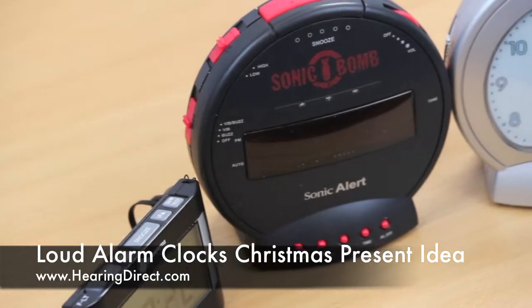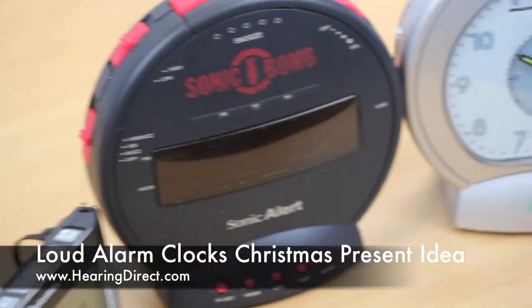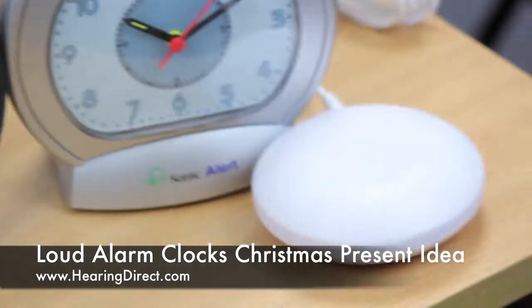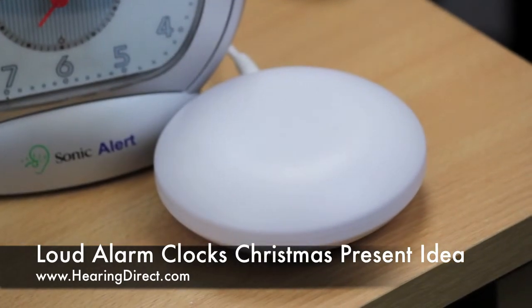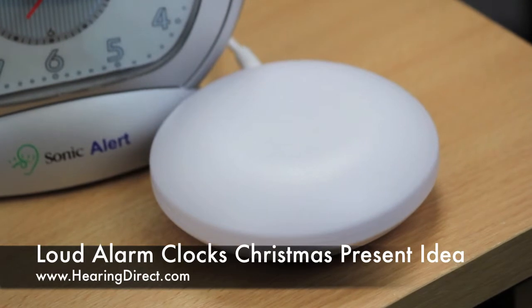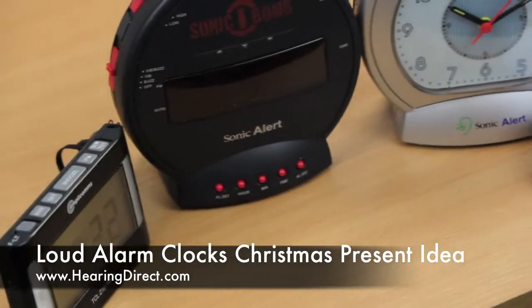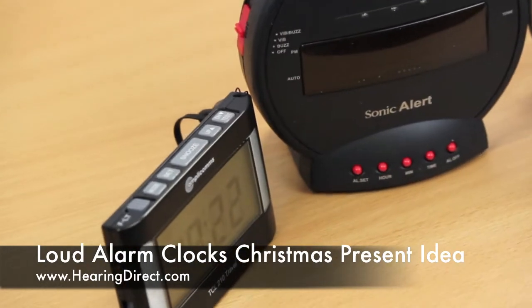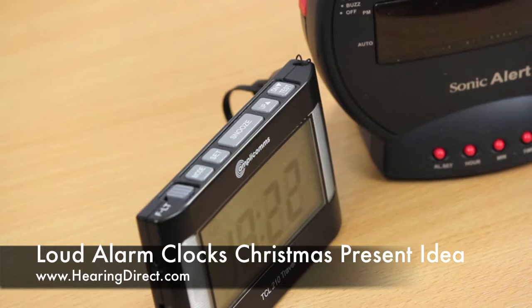Many of the amplified alarm clocks also have a vibrate alert function, so in addition to the loud sound that comes out of the alarm clock itself when the alarm goes off, you can choose to activate the vibrate function. On the travel alarm clock, this is built into the alarm clock itself, so the whole unit will vibrate, and many people choose to put it underneath their pillows so that it will definitely shake them awake.